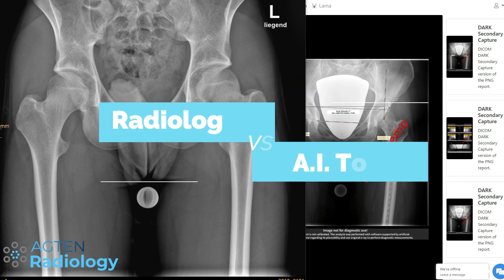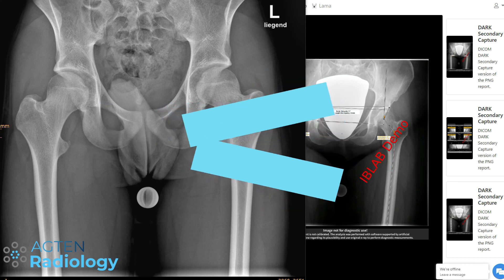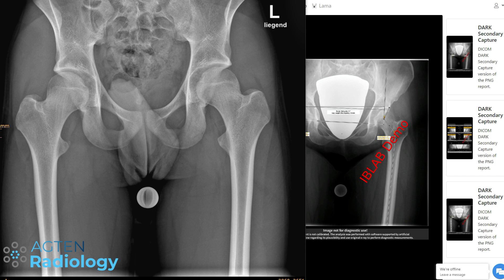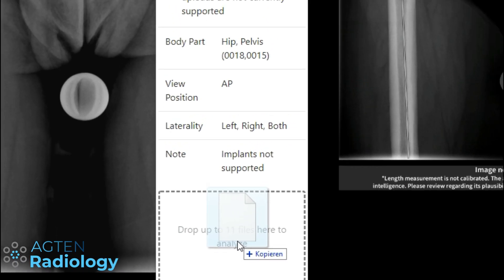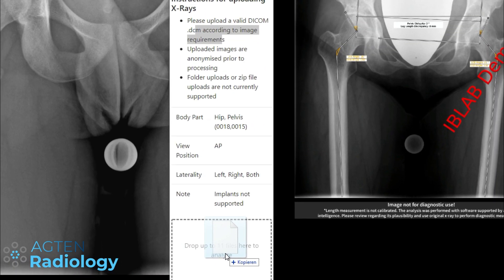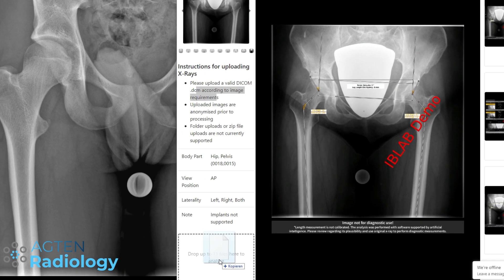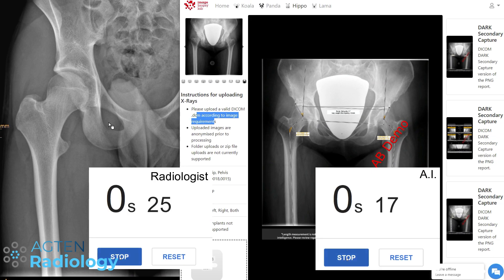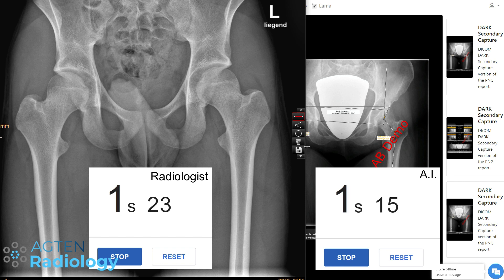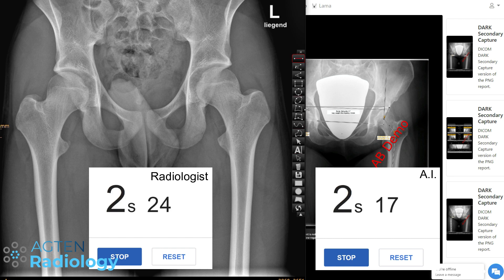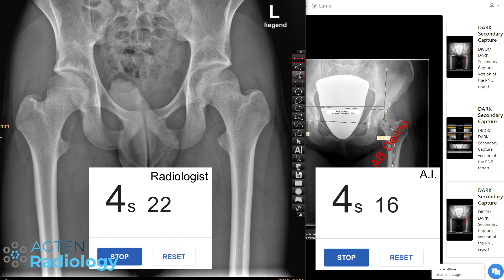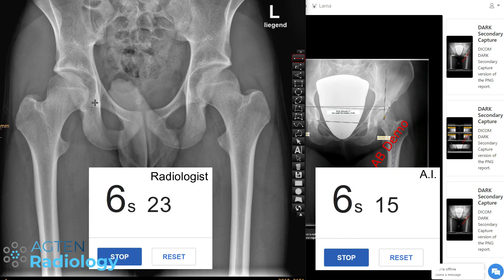So now I want to see how quickly I can do the measurements compared to the AI. Ready? Three, two, one, go! Okay, so I would have to first of all... okay, I don't have the tool here in this demo.